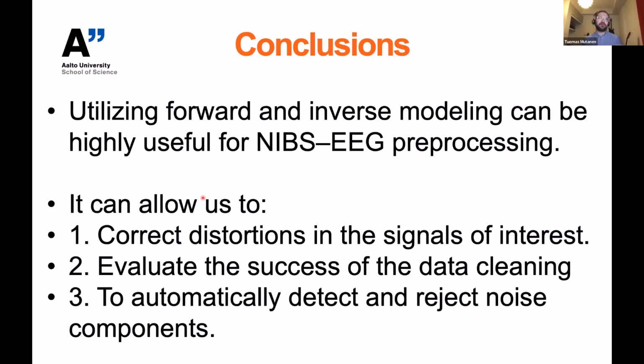You can use it to evaluate the success of the data cleaning when you are lacking the ground truth. That has been mentioned many times today, that it's very difficult to assess these techniques when you don't really know what the ground truth is. And SOUND demonstrates that you can use these to automatically differentiate between noise and signals of interest. And then ultimately, obviously, your goal is to reject the noise.